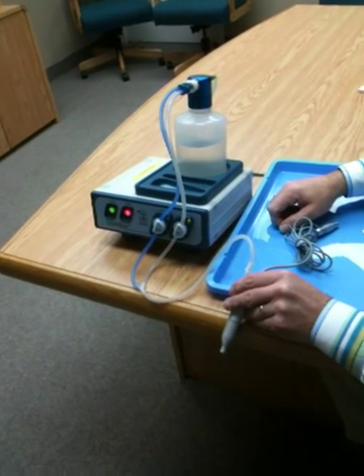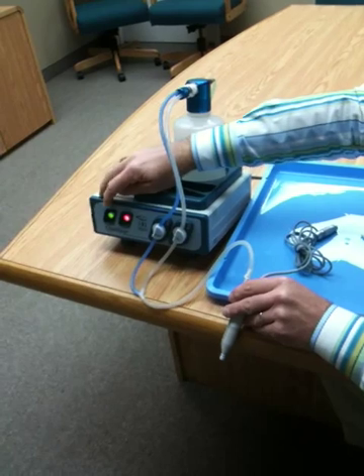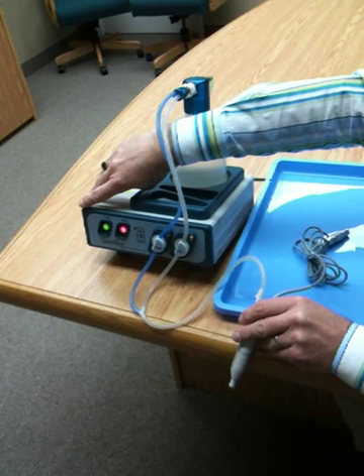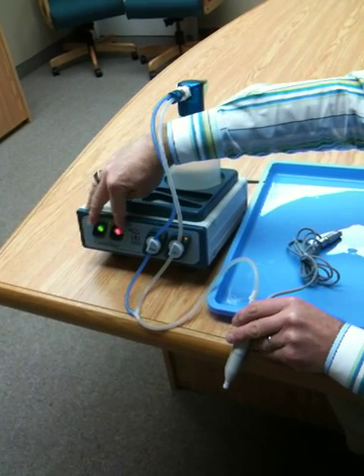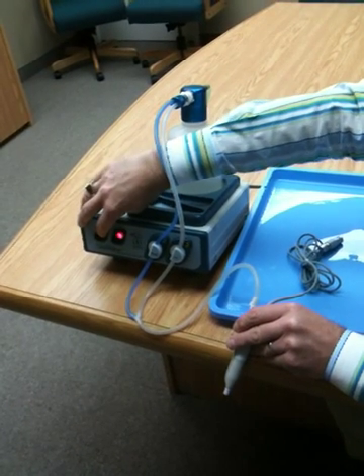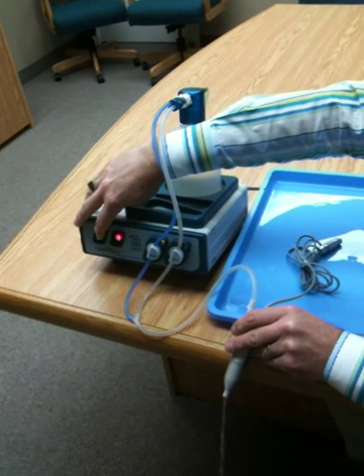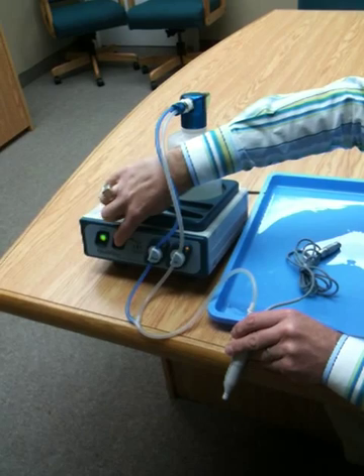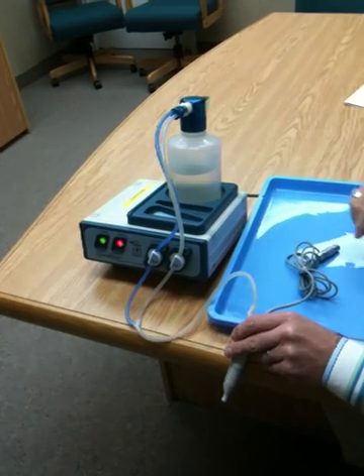At any time you can override the automated cycle by simply pressing the cycle switch a second time. It will switch to the air cycle and you can keep alternating it back and forth. But to reset the automated cycles, you need to always end by pressing the stop button.